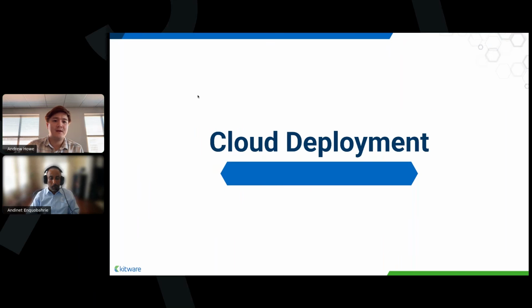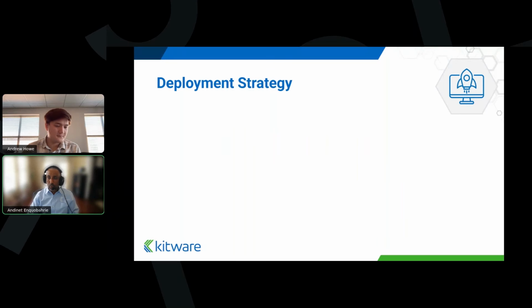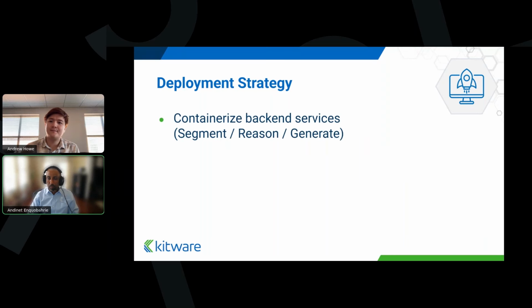And then cloud deployment is next, and Andinet is going to go over some of that. Great. Thank you, Andrew. Yeah, so I know we're running out of time, so I'll try to go quickly through a few items of interest to some of our customers and collaborators. The first one is, yes, this is fantastic, but how can we deploy it on the cloud, right? I just want to spend half a minute to talk about the best practices here.